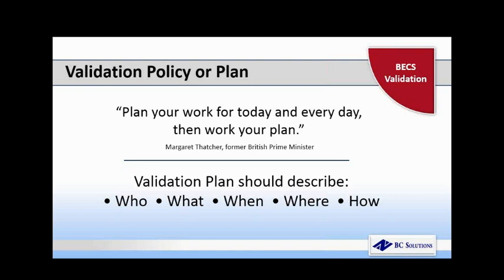You would decide what validation you're going to do when there is a major change. You need to make a definition of what a major change is in your facility. Is it going to be an upgrade to the system? Is it going to involve just a change in the configuration of the system? What do you consider to be that? What are the triggers for when you perform a validation? You also need to look at what's going to happen when you convert data from one system to another, or when you add new hardware or software. Are you going to redo your entire validation, or is it just going to be a few pieces and parts here and there?